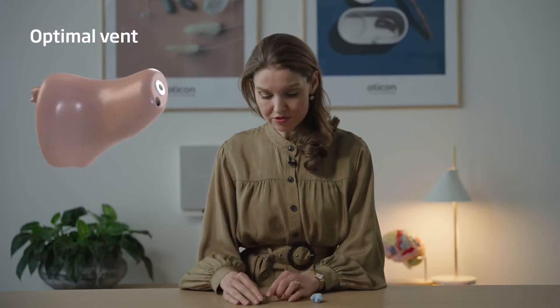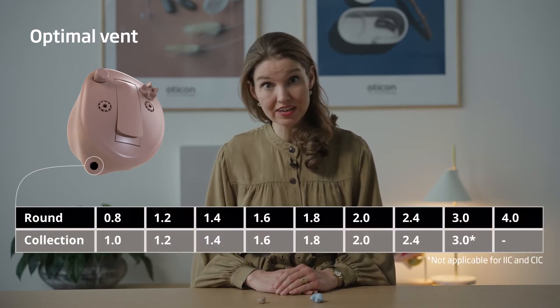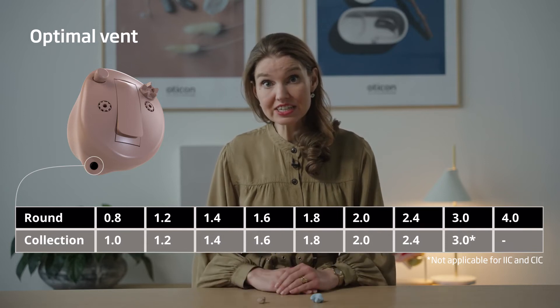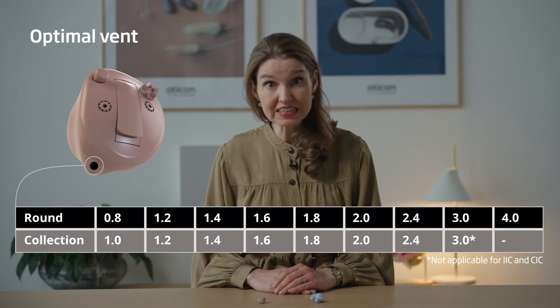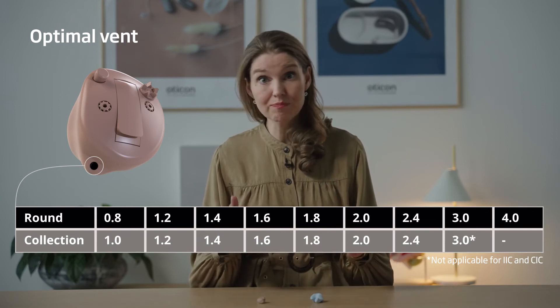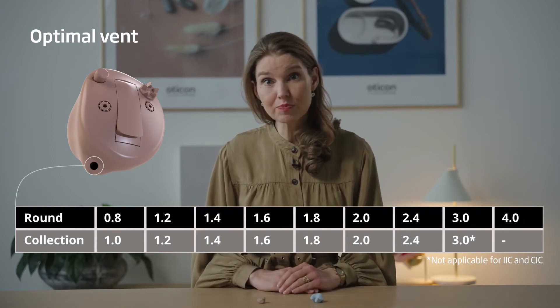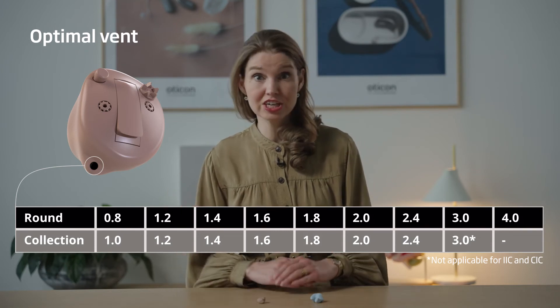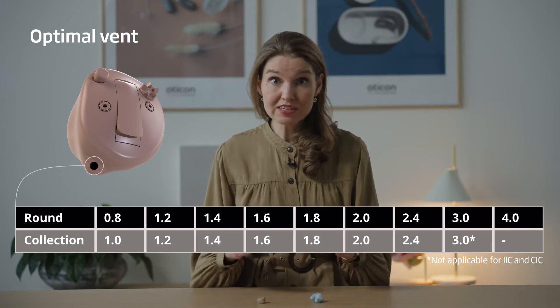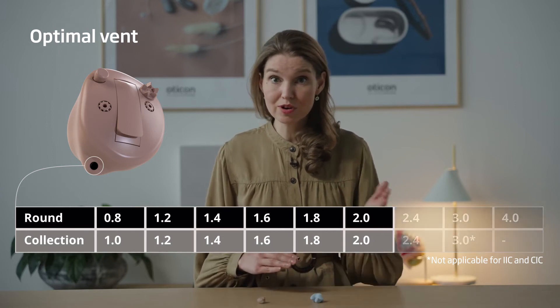Secondly, it's important to get the vent right. There are several vent sizes available to ensure a customized and individualized fit. This selection is based on measures of real ears. These measurements reveal that as the vent size increases from below 1 mm to 2 mm, the change in hearing aid response is quite dramatic. But further increases in diameter lead to a slower change in response. For this reason, there are most sizes to choose from in the range from 0.8 to 2 mm.